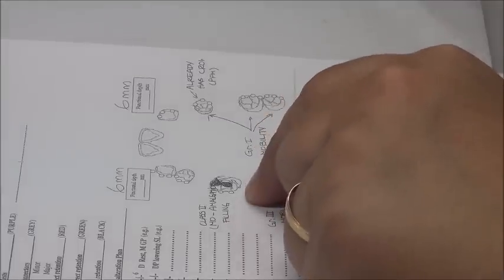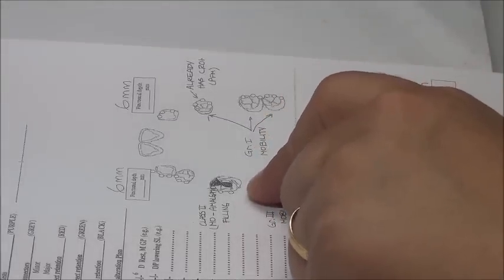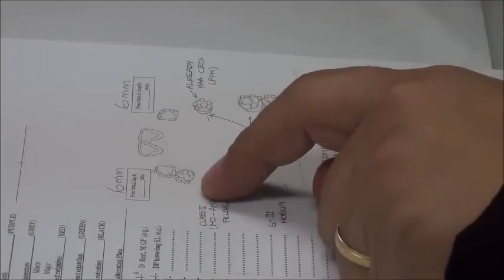Class 3 mod 4. Understood the idea? Because if the opposite 7 is not there, I also don't replace it, and it goes back to a class 3 with the modifications, okay? Understood? One of the saddle areas I counted for the classification. The others left are 1, 2, 3, 4, so it's class 3 mod 4. Okay? If I'm not replacing the 7.